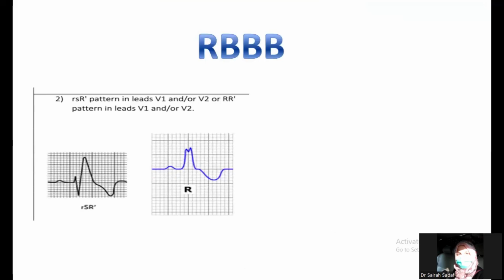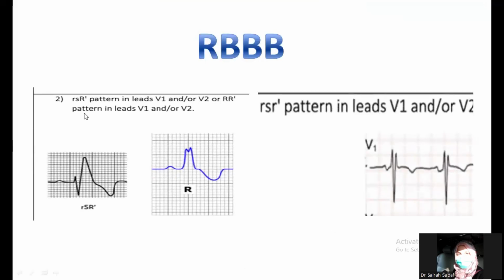Okay, this is just to show what the R, S, R wave patterns are. Now let me show you. This is the small r, small s, capital R. You may have this pattern, you may have this pattern, you may have this pattern.